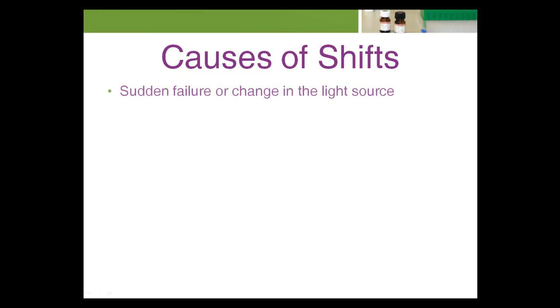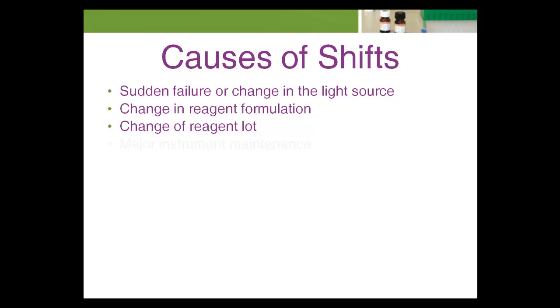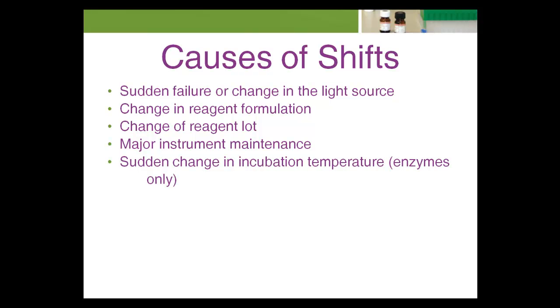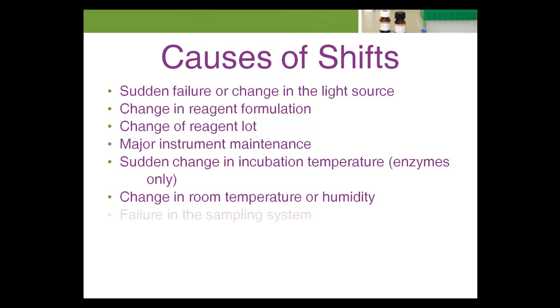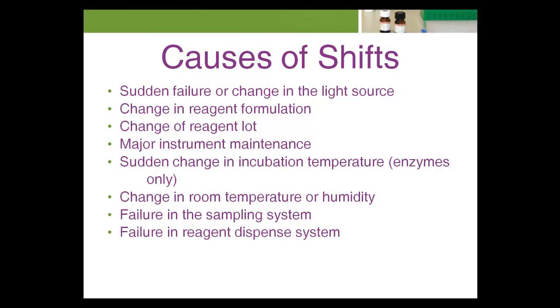Abrupt changes in the control mean are defined as shifts. Shifts in QC data represent a sudden and dramatic positive or negative change in test system performance. Shifts may be caused by sudden failure or change in the light source, change in reagent formulation, change of reagent lot, major instrument maintenance, sudden change in incubation temperature (enzymes only), change in room temperature or humidity, failure in the sampling system, failure in the reagent dispense system, or inaccurate calibration or recalibration.